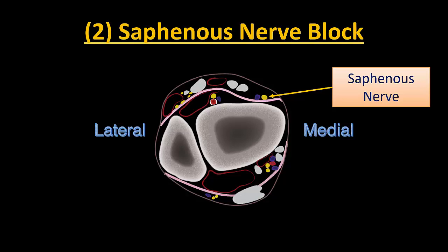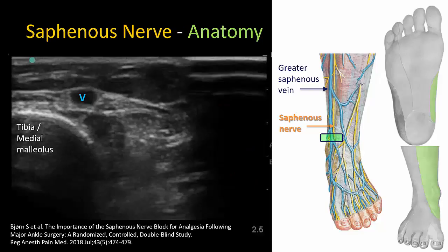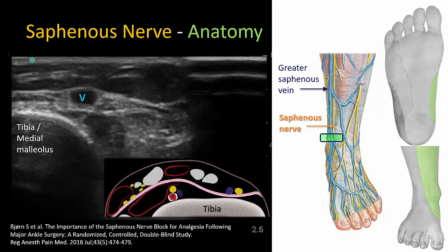The second nerve to block is the saphenous nerve, which is easily done with the leg maintained in the same position as for the tibial nerve. The saphenous nerve innervates both cutaneous and deeper structures over the medial aspect of the ankle and foot. The primary landmark is the greater saphenous vein. Both descend anterior to the tibia and medial malleolus and lie in a subcutaneous location superficial to the investing crural fascia. The vein and nerve are sandwiched between two fascial layers. The usual strategy is to inject local anesthetic into the same fascial plane as the vein, which will guarantee blockade of the saphenous nerve whether it is visible or not.